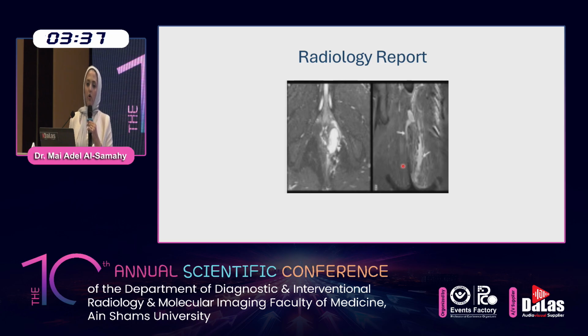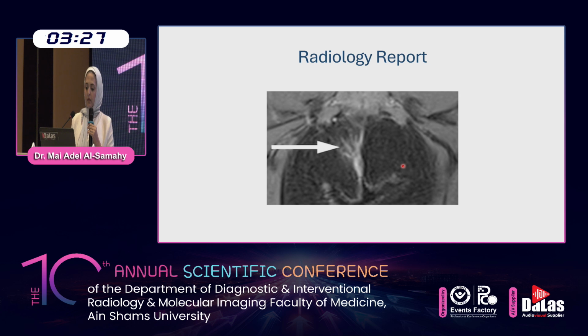We should be aware of any complications, an abscess tract, a secondary branch, any possible complication should be mentioned in our report. Also, we should give a proper idea about the secondary branches. Some fistulae are so complex and branching that you cannot actually know where is the main tract.